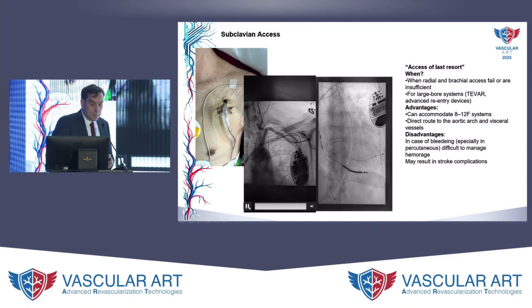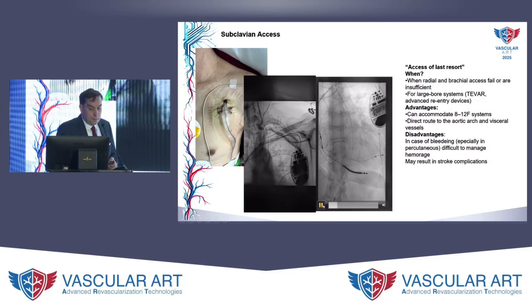Okay, so you can see the sheath just below the clavicle, and then the second movie, it's the working pressure balloon in the aorta.